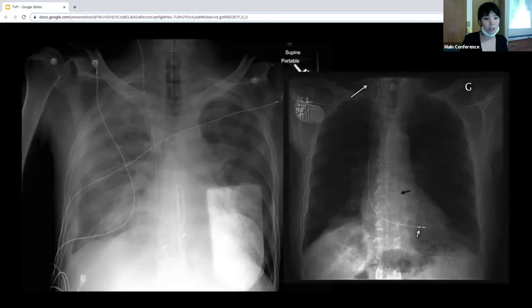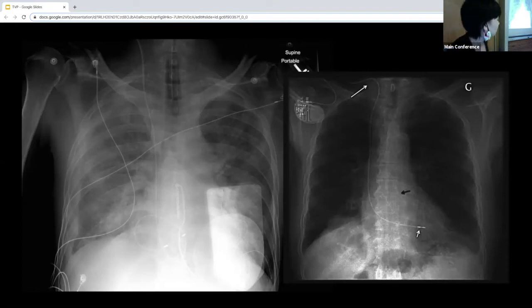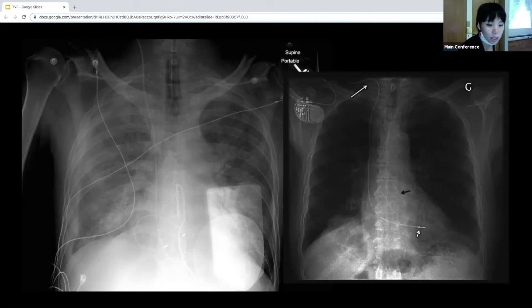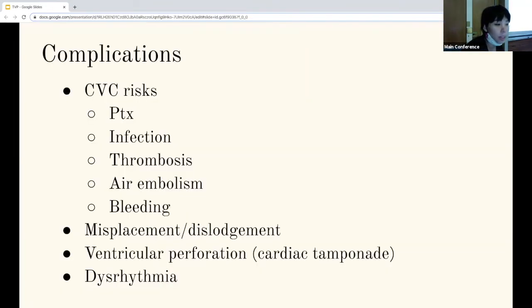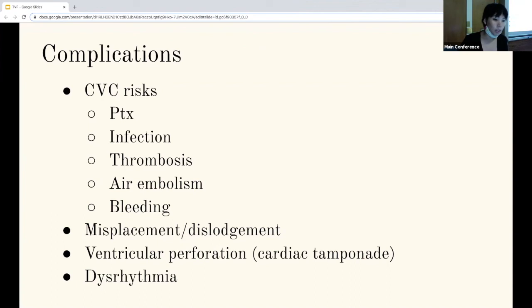You also want to get post-procedure X-rays. On the one on the left, you can see that the pacer wire is coiling in the RV, which is acceptable. On the one on the right, you can see the tip at the RV apex. Some complications of this procedure include those associated with central line placement — pneumothorax, infection — and specific to the transvenous pacer itself: it can be displaced or dislodged, you can get ventricular perforations, and you also want to check for signs of cardiac tamponade.